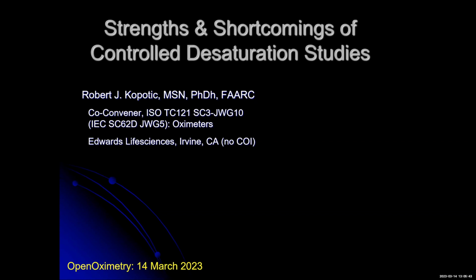Again, recognize this is a standard for the manufacturer of a device, not a user. There are no clinical guidelines in there. We are actually restricted from the practice of medicine, even though we have clinicians heavily involved as experts. We're not to have that information in the standard.